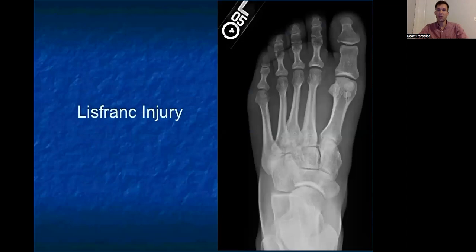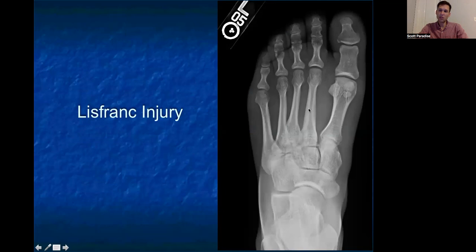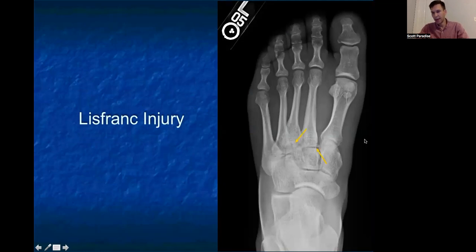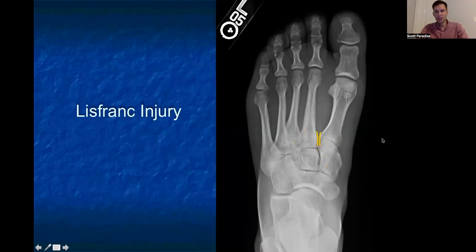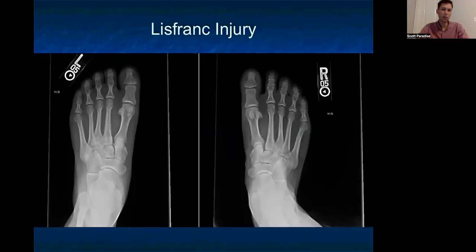Like all x-rays, I'm going to start distal and look at each phalanx in order, then look at the metatarsals. I see an incidental bipartite sesamoid right here, and then moving down, looking at the bases, I see some lucencies here and here which I'll make note of. Looking at the tarsal bones and navicular, I'll examine the Lisfranc complex. I see those lucencies I pointed out, also an extra little bony fragment right in there, and the Lisfranc complex appears a little bit widened. Comparing to bilateral weight-bearing films of the feet, the left does look a little wider than its counterpart on the right.